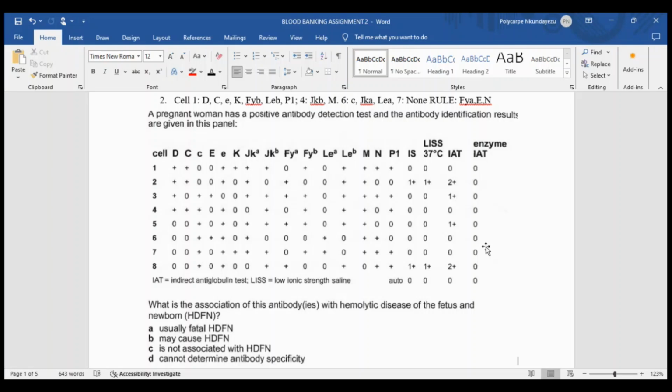Thank you so much. So there are two things now. It's no longer one, because I had something from Bright. So I want to include it in my comment. My comment would be that the responsible antibody in this panel, which is associated with the reaction, is not E. It's not E for two reasons. It is FYA or Duffy A antibody, or antibodies to Duffy A.